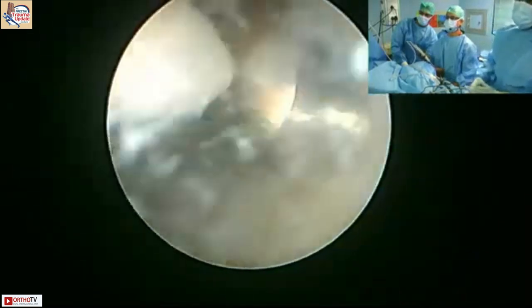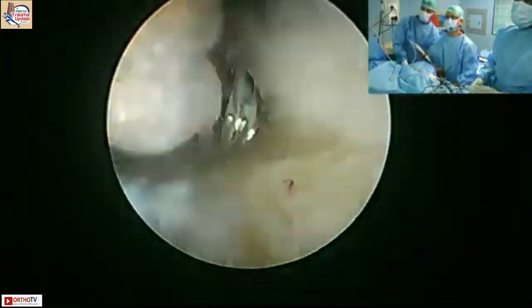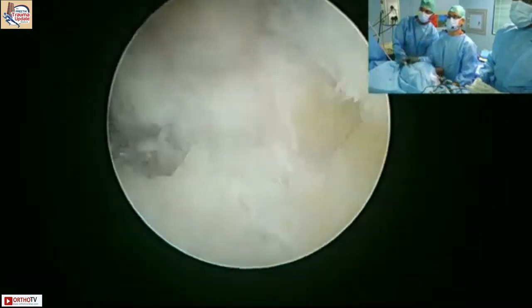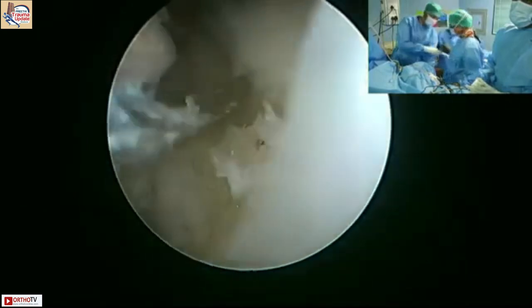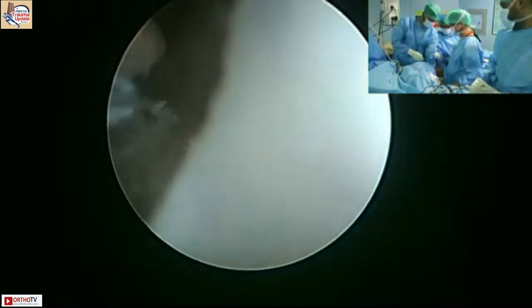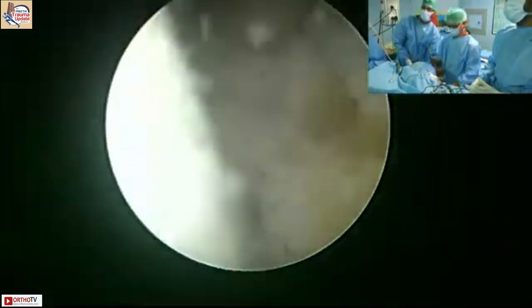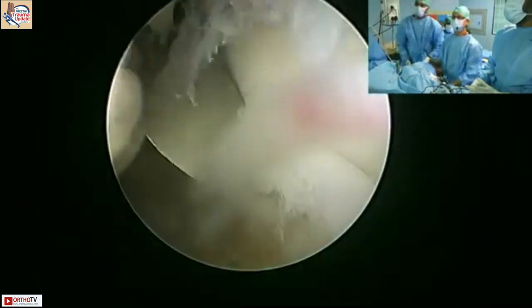Yeah. So what we need to do now is just take this. So you can see, I've come to the cartilage level. Yeah. So I just need a periosteal elevator. Give me that shoulder periosteal elevator. Liberator. The other one. And I'll just break this. Is it possible to show the posterior portal for the audience if you can?